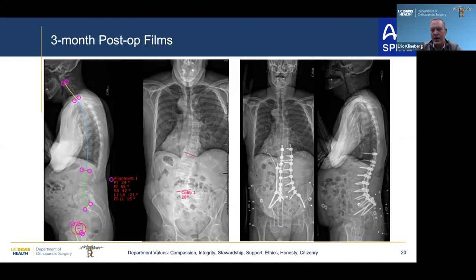No, I think that's exactly right. So those top screws, you really don't want to see any stress. So those get final tightened at the very end, and we're just setting a set cap on it. Usually the rod is pressing down into the tulip, so there's no reduction, no compression, no distraction. You really want to just have those lie where they are. And then we use Mersilene tape to instrument the UIV plus one.